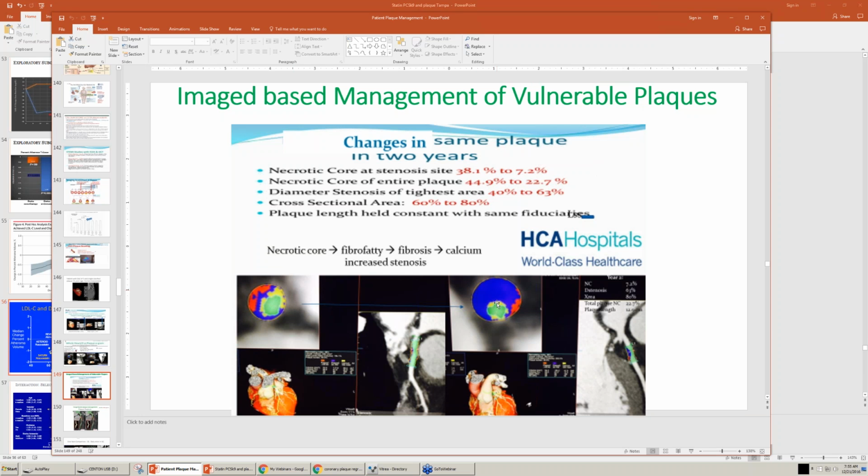So this plaque is much less dangerous, and I have much more confidence in this person developing angina before they have a cardiac event, and the cardiac event rate being lowered from 75% to 25%.